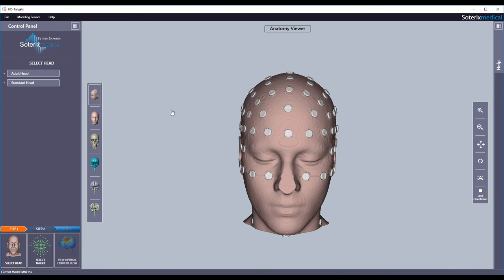If you want to explore optimization for different targets, just repeat these steps. For other region-based or EEG-guided targeting options, watch our other videos. HD Targets, another innovation only from Soterics Medical.